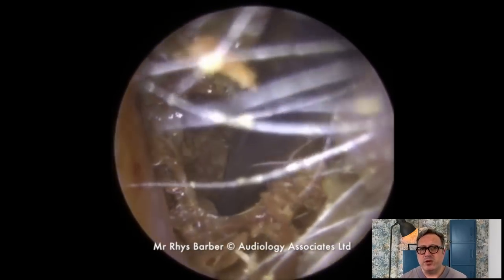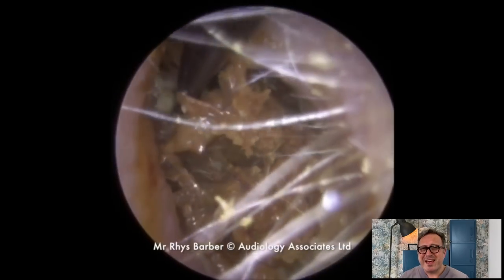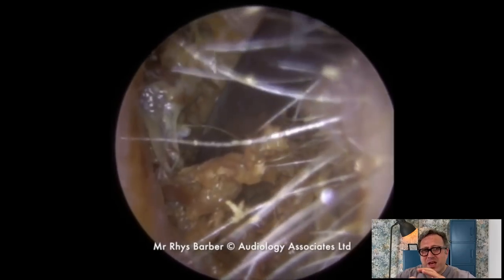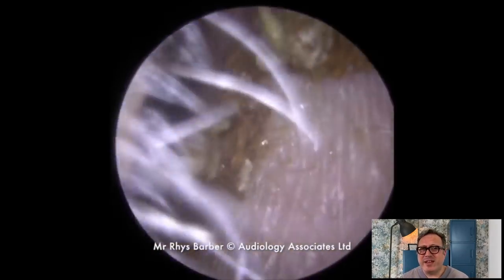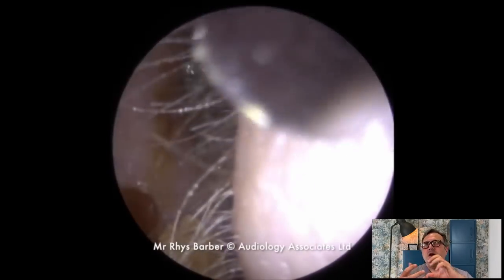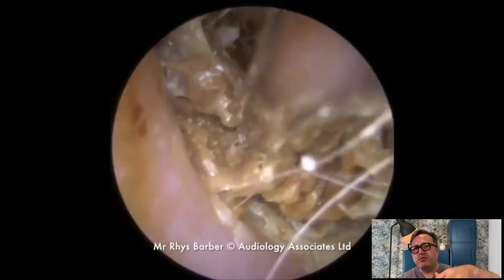So we're going to use the jobson horn here. You can see, as we push into it, the layers pulling apart, all separating out a little bit. We're not really getting a good grip. If this was obviously a solid piece of skin or a solid piece of wax, then as you go in there with the jobson horn it will get the bite to pull through.